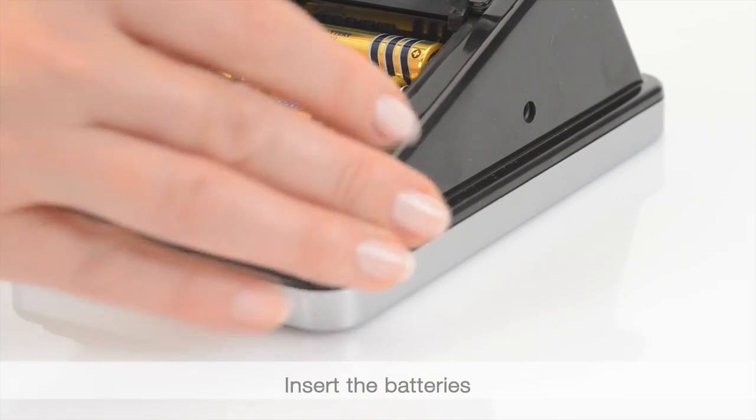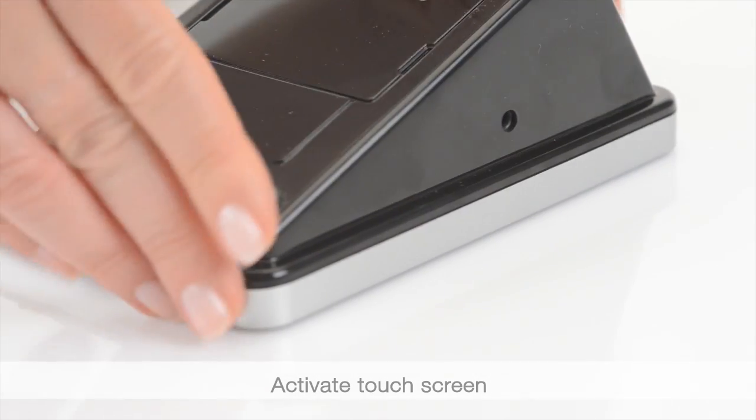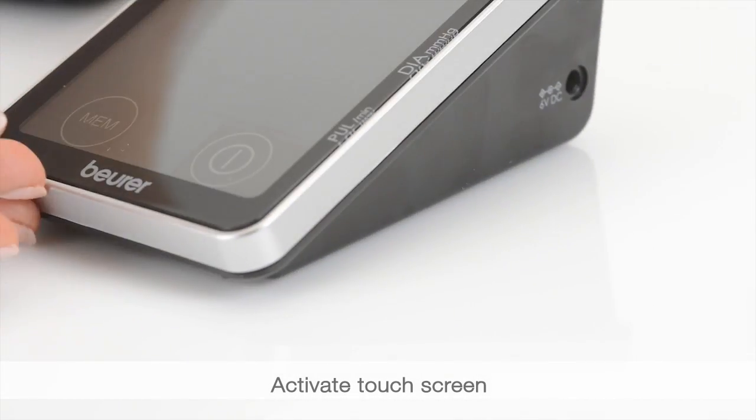Insert the batteries. Move the touch screen activation switch to the on position.